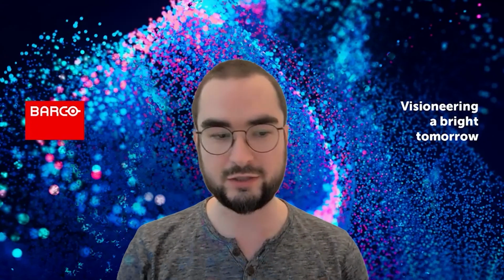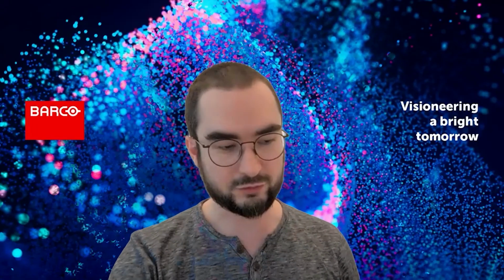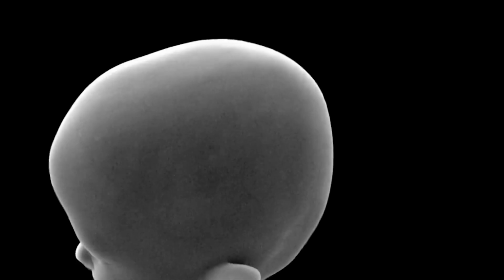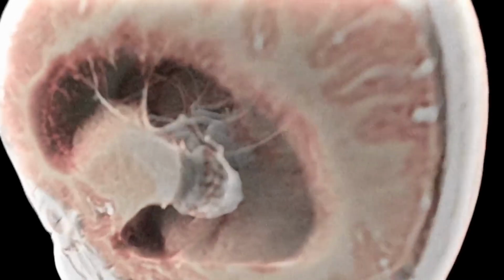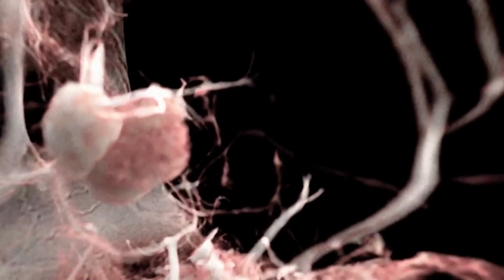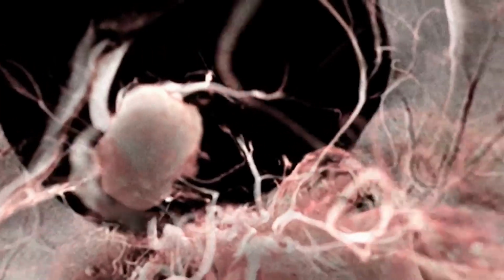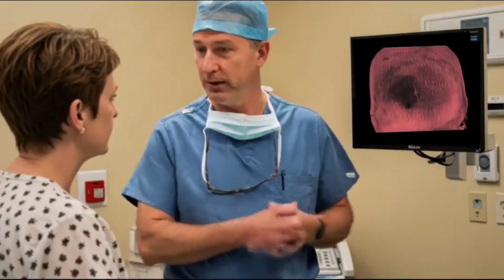That is unlikely to change in the near future. However, what is important is that this data is already 3D data, technically. They're just looking at it in intersection in 2D ways. So what you can do is take this content and render it volumetrically. You take all the slices, stack them like a cube, and then render that, and you have raw data rendering that can be very useful for other use cases, such as procedure planning.